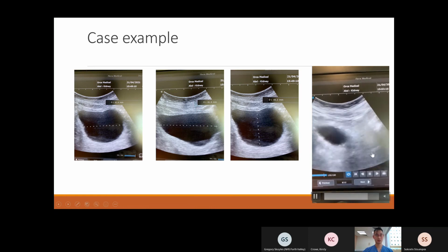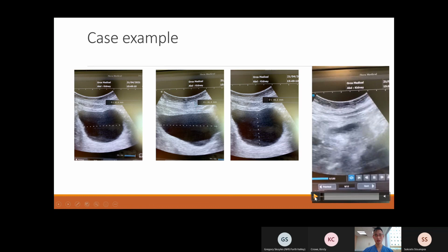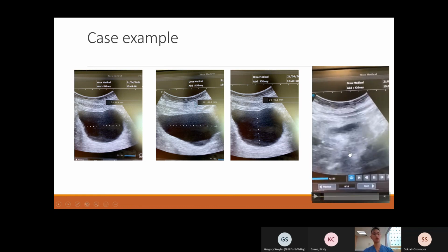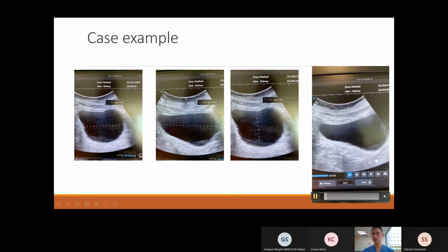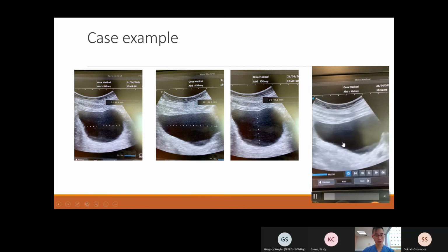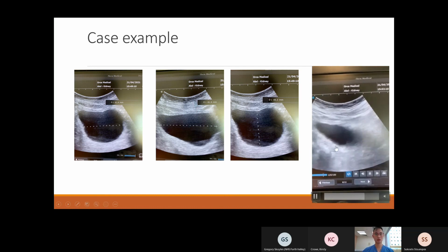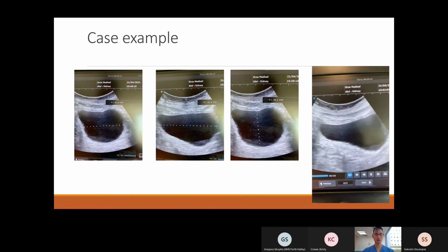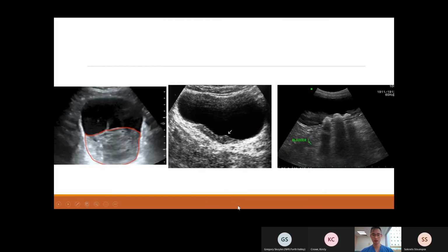I think that this is probably sedimentation. It could also mean that he's got a UTI and that he's got pus cells in there, sediments, or it could just be that he's a CKD patient and it's just got manky stuff in his bladder. But it's useful that the bladder ultrasound could show us that and favor a diagnosis of possibly a UTI. So the bladder ultrasound is useful in that sense.